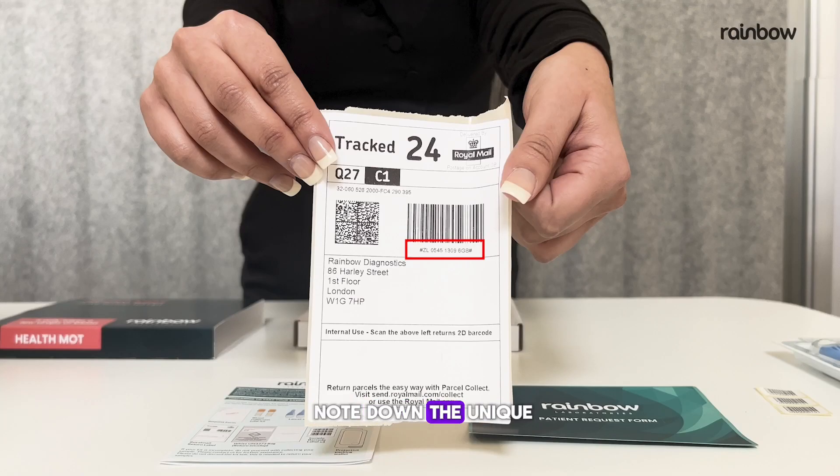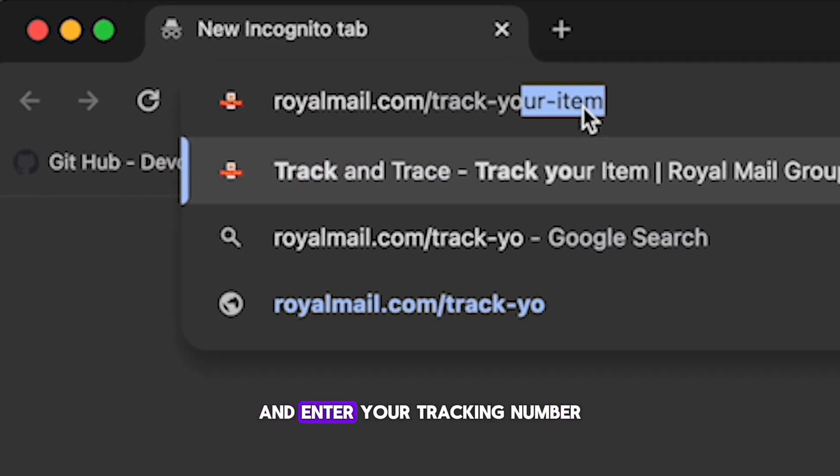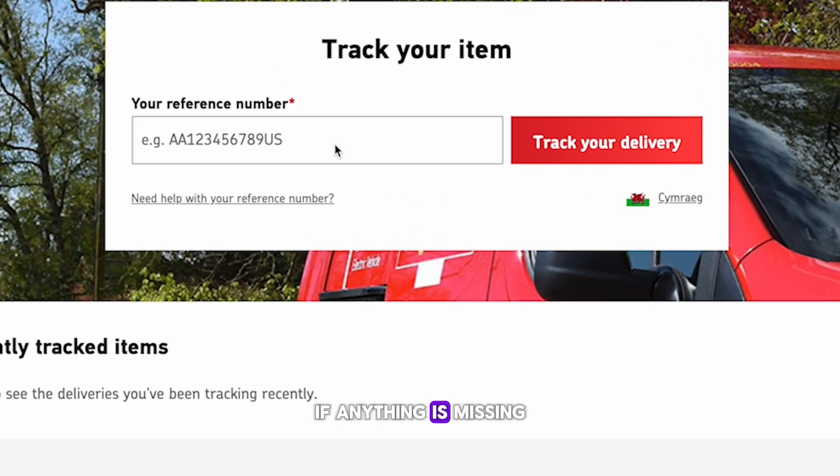Seal the bag and affix the Royal Mail return label on the outside. Before you post your sample, take a moment to note down the unique tracking number displayed on the barcode of your postal tracking label — keep this number safe, as it's important for tracking your sample. To check on your parcel's journey, visit the Royal Mail website and enter your tracking number. If anything is missing from your kit, please contact us for assistance before proceeding. Remember, do not discard the kit box as it is needed to return your samples.